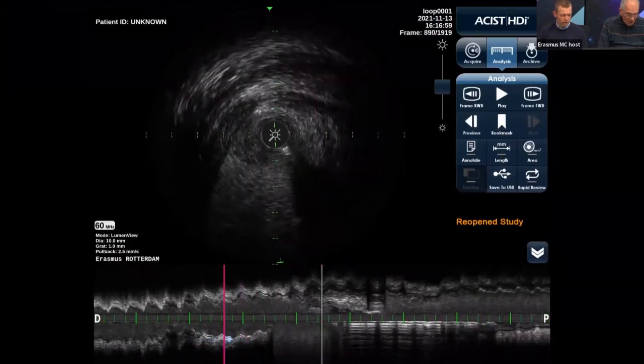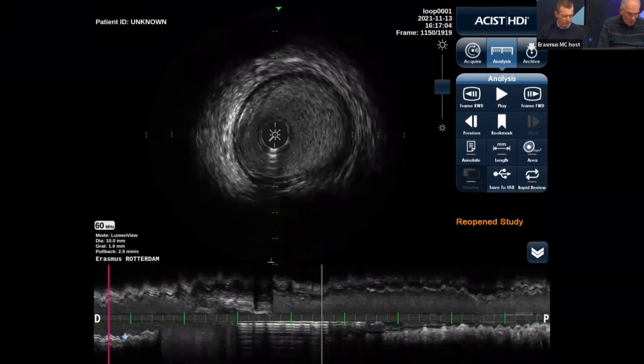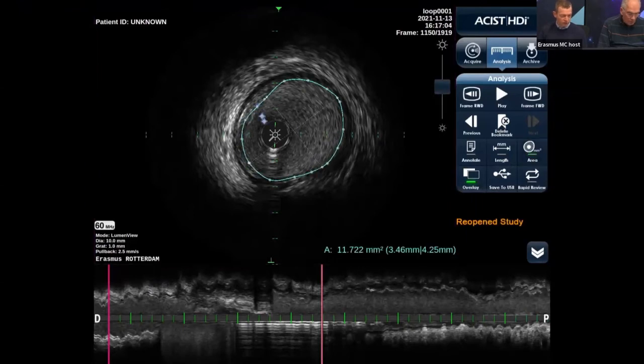So obviously, in this case, this is not so relevant. But just to demonstrate to you that if you have IVUS in a patient with this stenosis, IVUS can really help you to get a better impression of the severity of the significance of the lesion. At least what I learned from the experience here with imaging and physiology is that if the luminal area in a large coronary is below 2.5, the likelihood that it will be functionally significant by FFR, iFR, NHPR, vFFR is virtually 100%.